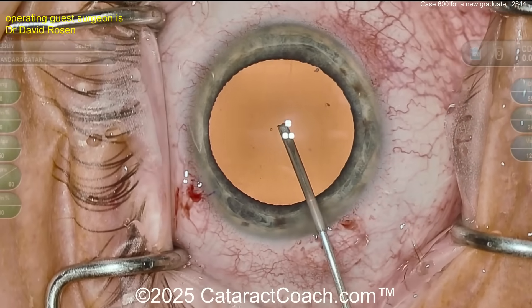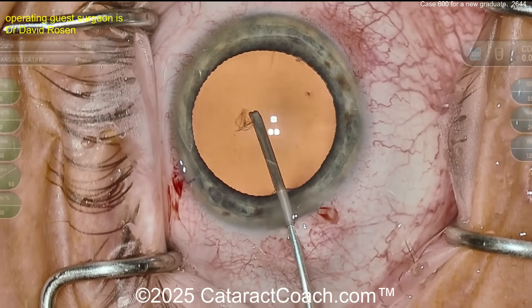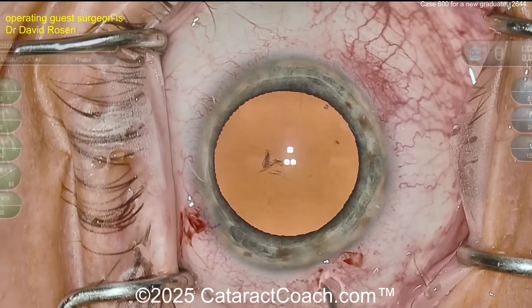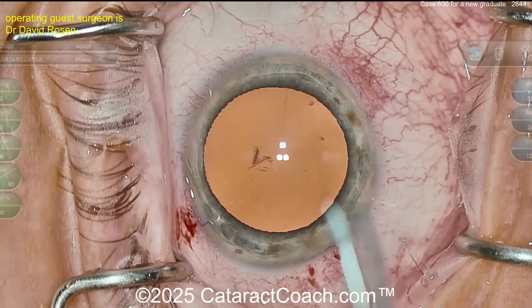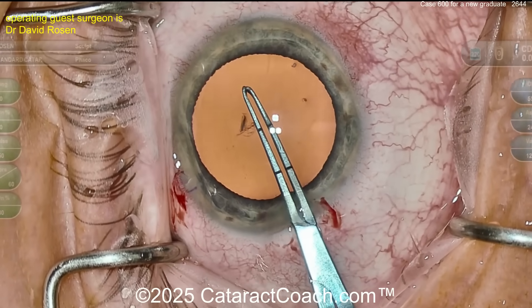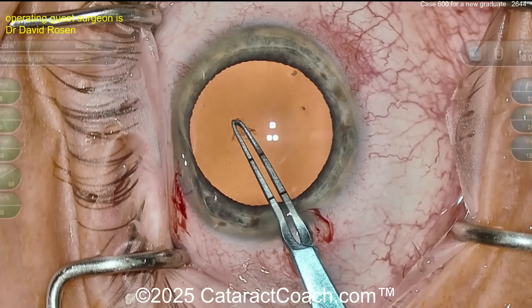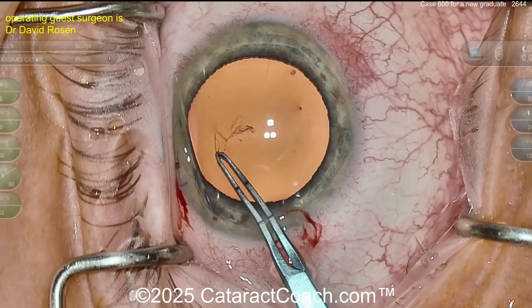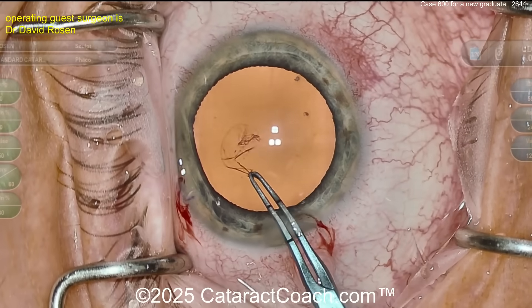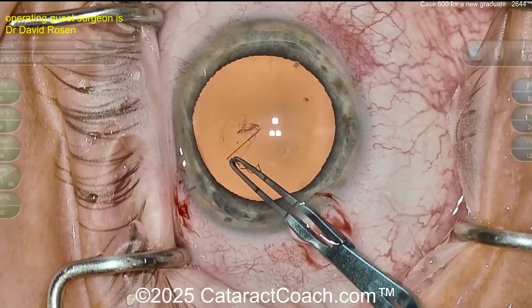Now the cystotome going in to puncture the lens capsule — that puncture looks pretty good. No zonulopathy we can detect yet; that looks good, a little bit of opening of the lens capsule. Now the forceps — looks like marked forceps too, measuring out: two and a half and five millimeters. Let's grab that lens capsule and see the technique here.